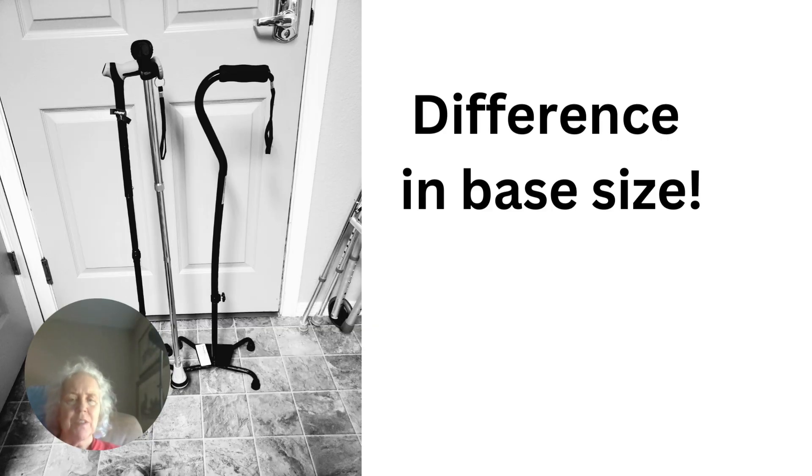Here are the quad canes with the difference in base size again. You want the one on the left — it's put out by ReHand, and it's very sturdy. It's got a nice grip, the height is adjustable, and it's very stable and does a great job.